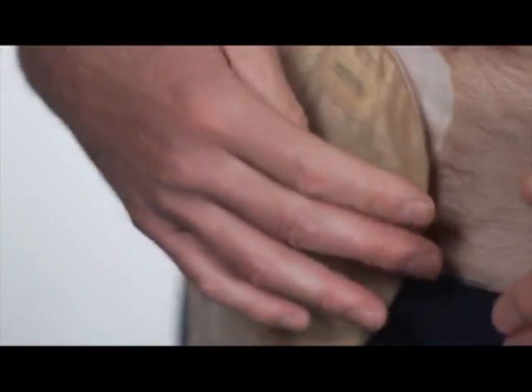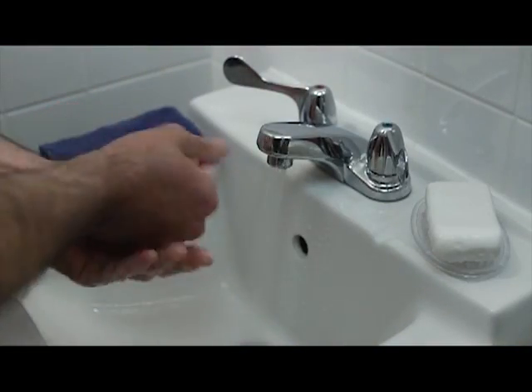Make sure to check that the pouch is completely locked to the flange. Make sure to wash your hands thoroughly.